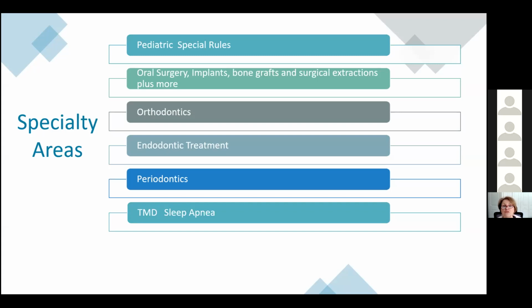There are specialty areas, just so you know. Any pediatric CBCT use has special rules around it. So that's a special entity, and we need to be careful if we're using that for pedo. Oral surgery for implants, bone grafts, surgical extractions, and so many more.